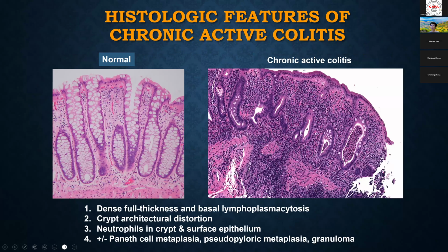On biopsy, chronic colitis has very characteristic features. Here we can see a normal colon, with the typical test tube arrangement of the crypts. They are the same size and same caliber, run in parallel, and sit on the muscularis mucosae. You do see a few inflammatory cells, but not too many, more towards the surface, and then gradually tapering down towards the base.